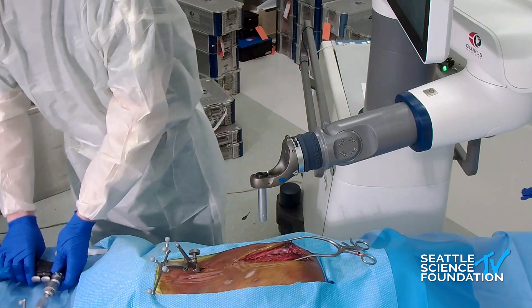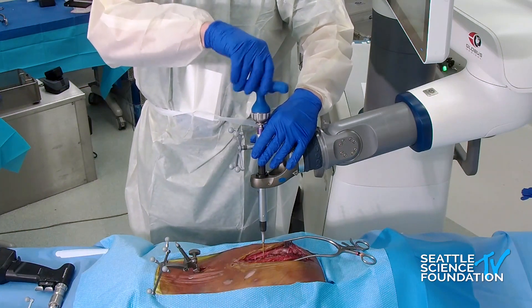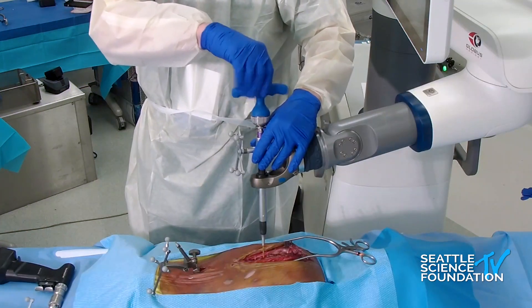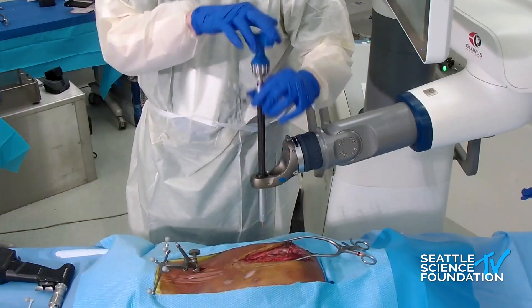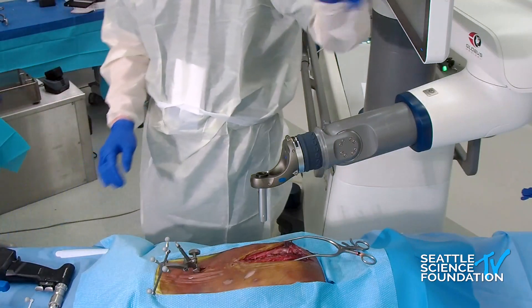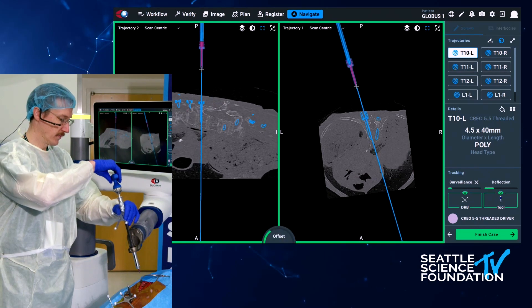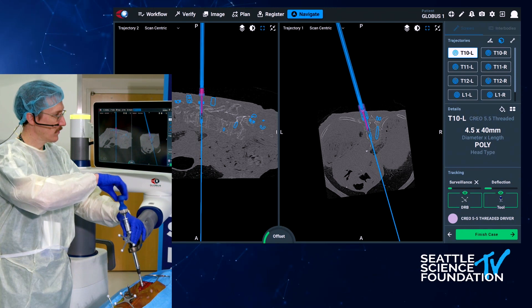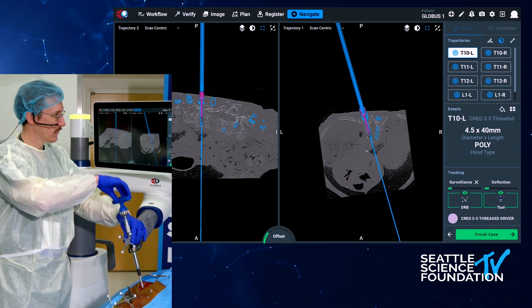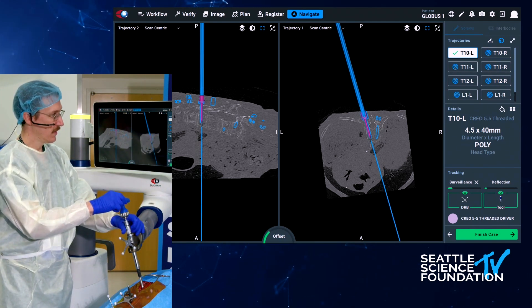I'm a tapper, so I'll take my tap and tap down the hole. And then we'll take our screw — in this case, it's going to be a 4.5 by 40 millimeter polyaxial screw. And when I've reached my depth, I get a check sign that lets me know that I have gotten there.